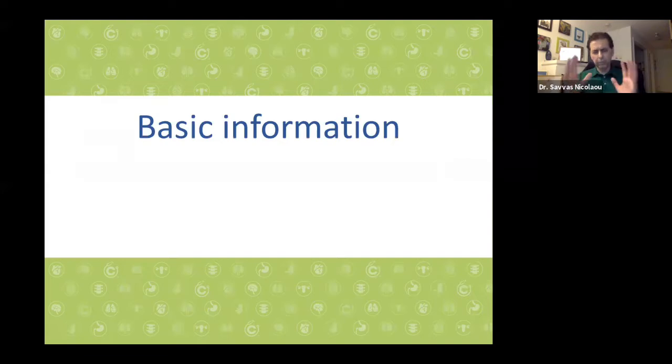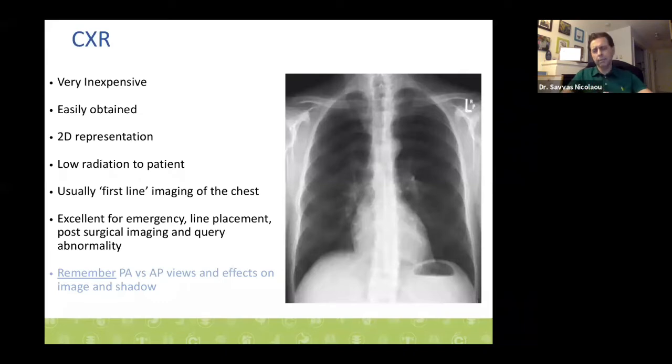Now, let's move on. That was the imaging modalities. Let's move on to the second portion of the talk, basic information that we need to know as we lead to a basic approach, the chest radiograph.